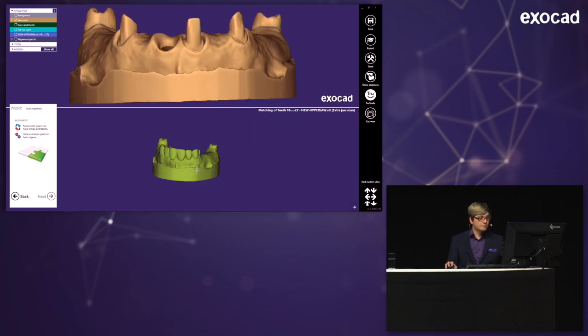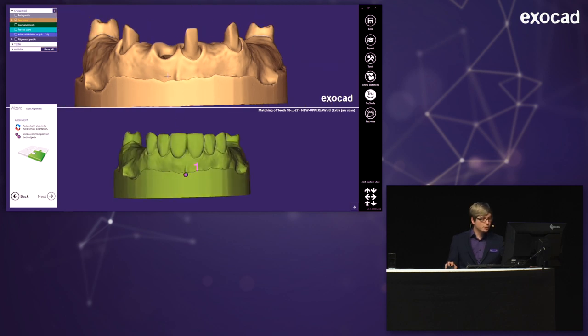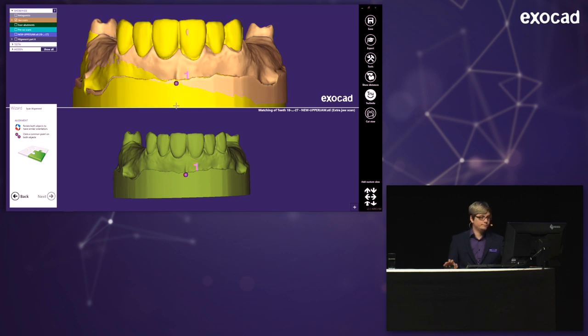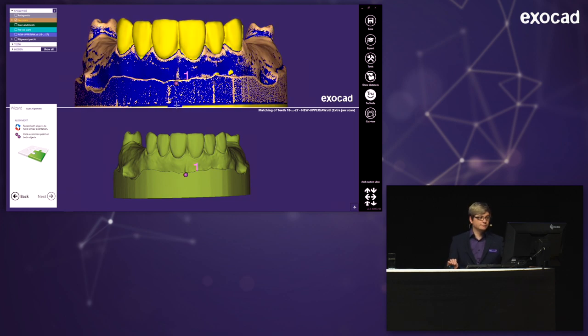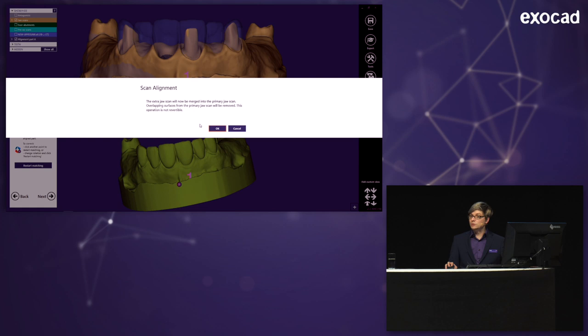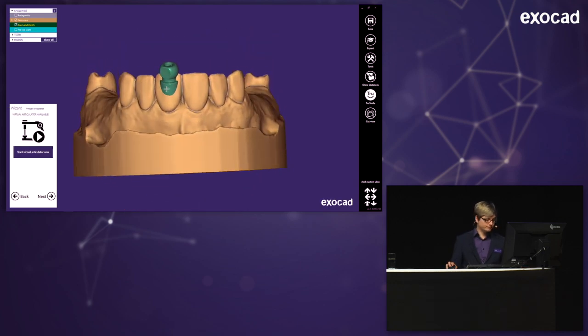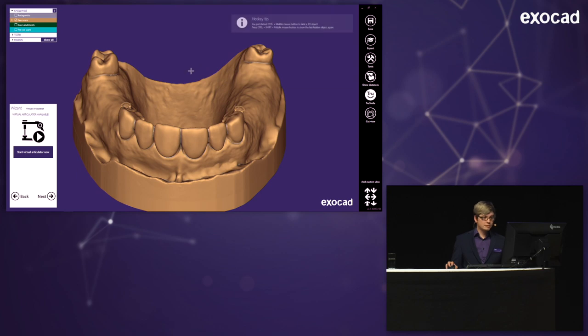And now I have to align the new jaw scan with the old model. And for this, I try to rotate them in the same direction and choose one point on both of them, I think this here, and then it aligns them automatically. And if I now hit next, it's going to ask me if I actually want to merge them, and I want to. And it warns me about that because I won't be able to revert this change. And so now this is my model. And I could now start the virtual articulator, the whole shebang again.